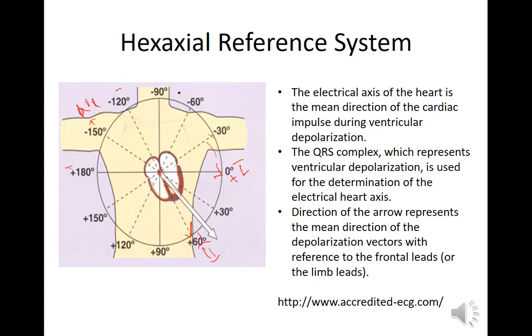I have a question. Sure. How does that work with only 4 electrodes? Well, that's what the machine does, right? The machine bases it on the bipolar lead. So it's really 3 electrodes, and that's Einthoven's triangle. It's all based on this miraculous thing. Okay, I figured it out. I think that guy was a musician too.